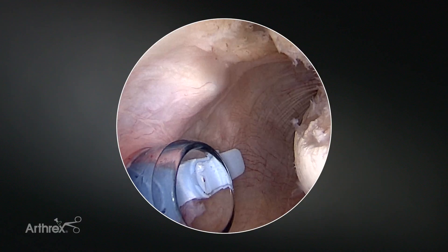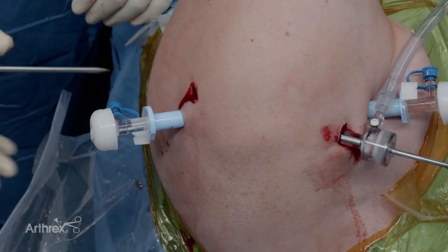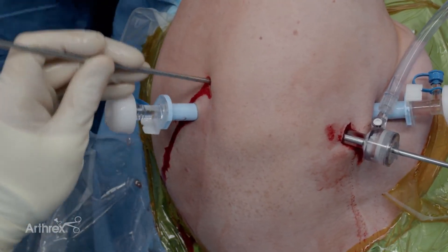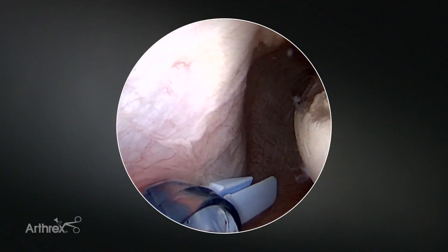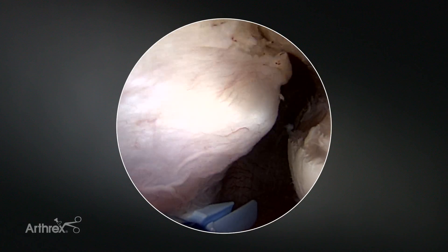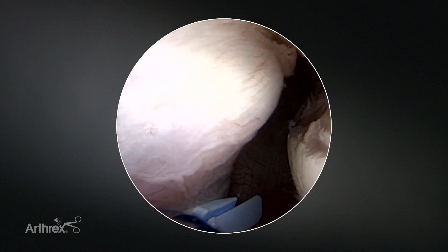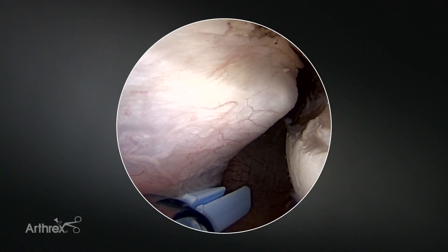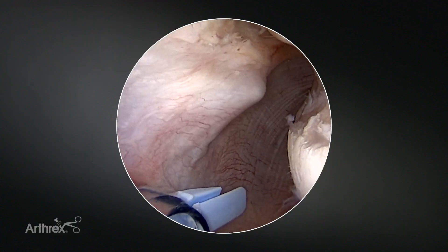This is pretty good here because I'm right in the center of the defect. Next I'll take a switching stick and I'll go down to just above the posterior capsule to confirm that I'm at the right location. We can see the switching stick — we are clearly just above the posterior tissue. I'll insert another seven millimeter threaded cannula.